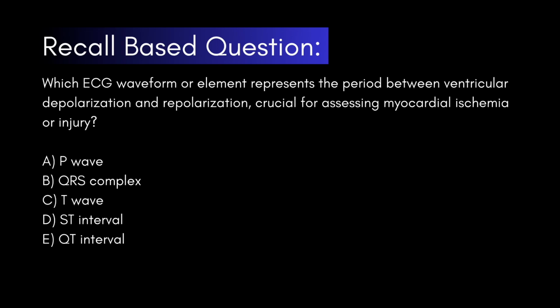Which ECG waveform or element represents the period between ventricular depolarization and repolarization crucial for assessing myocardial ischemia or injury?